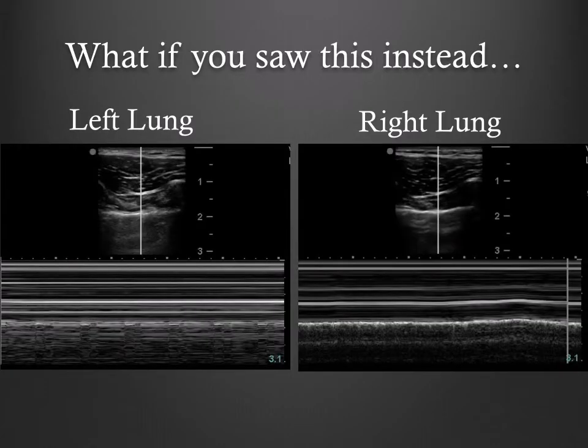Imagine that you instead notice what seems to be an inconsistent pattern. You notice that you have lung sliding on the right, but do not have lung sliding on the left. However, your lung pulse is present bilaterally, ruling out pneumothorax. Your unifying diagnosis is right mainstem intubation. Your lung pulse remains as the heart continues to beat; however, you are no longer ventilating your left lung, and therefore do not see lung sliding beyond movement induced by the heart.